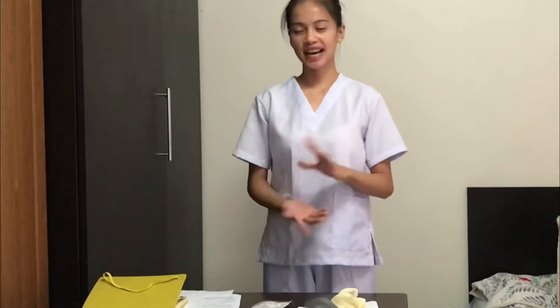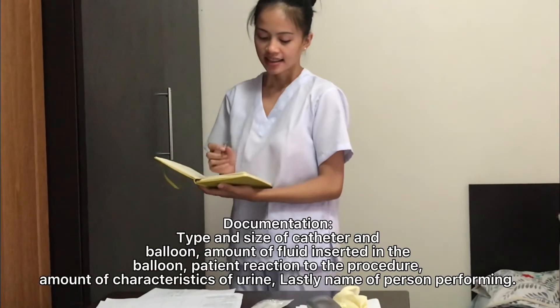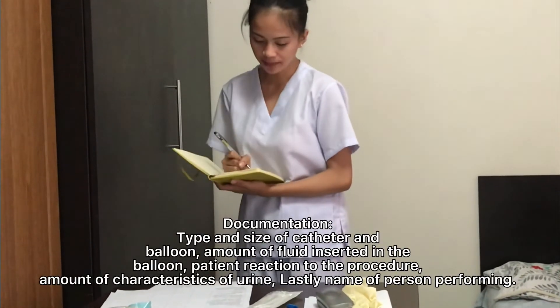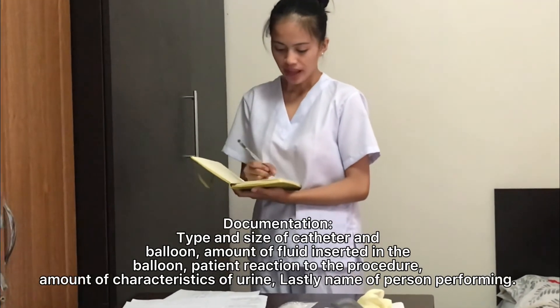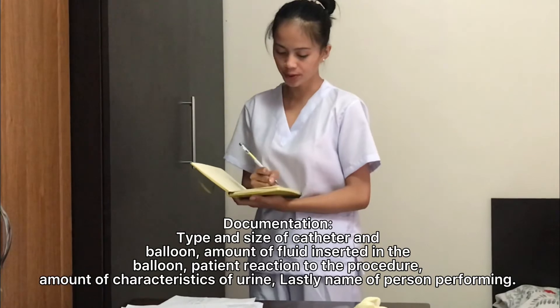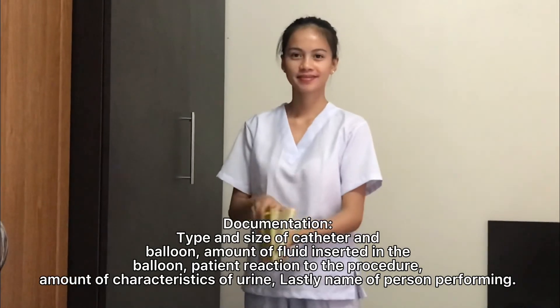After performing hand hygiene, do the documentation: the type and size of the catheter and balloon, amount of fluid inserted in the balloon, patient reaction to the procedure, and amount of urine drained. And that's all. Thank you.